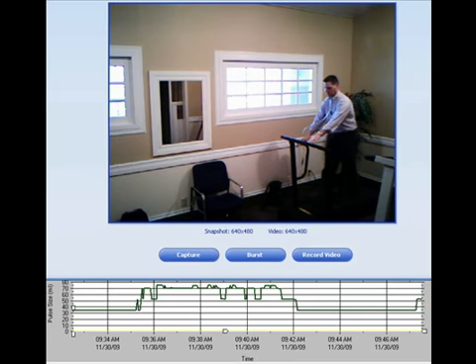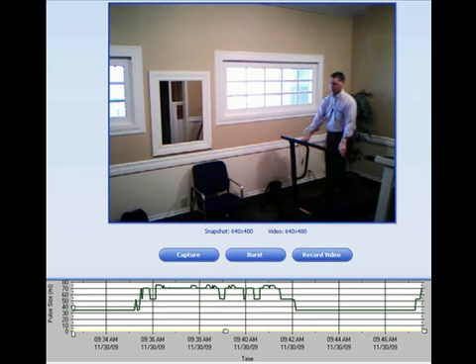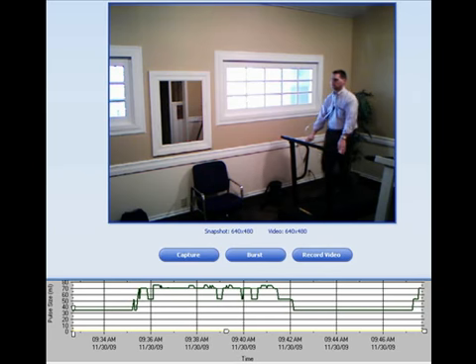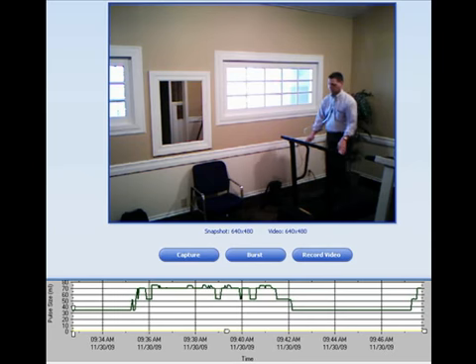This is what is revolutionary about SmartDose. When patients titrate manually, they don't feel that they need an increase until they become symptomatic, and then it's too late. They are already desaturated and breathless. Let's jump ahead one more time.